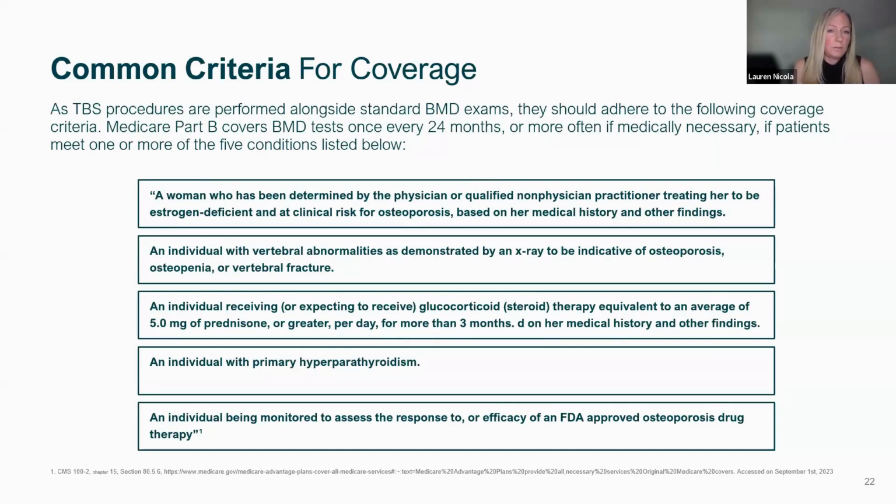So when is TBS covered for patients? Well, it's performed alongside standard BMD exams like DEXA, so it adheres to the same coverage requirements as DEXA.